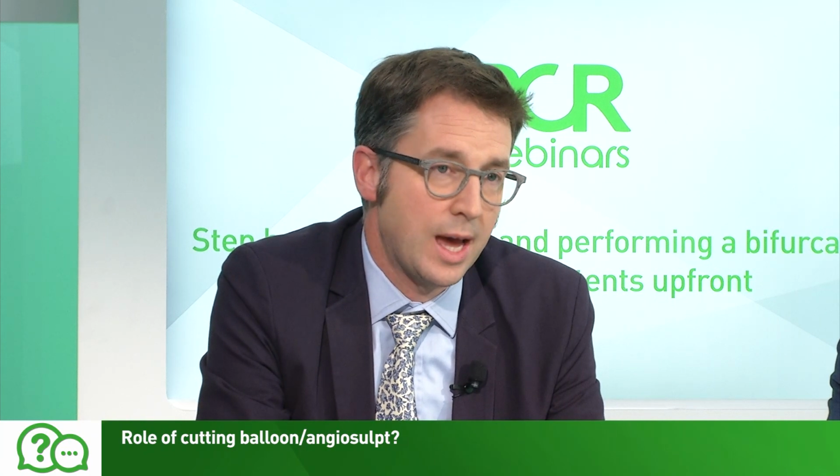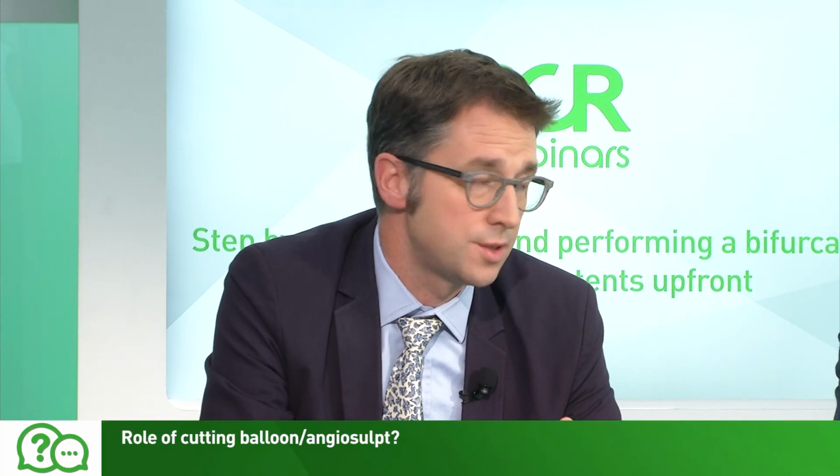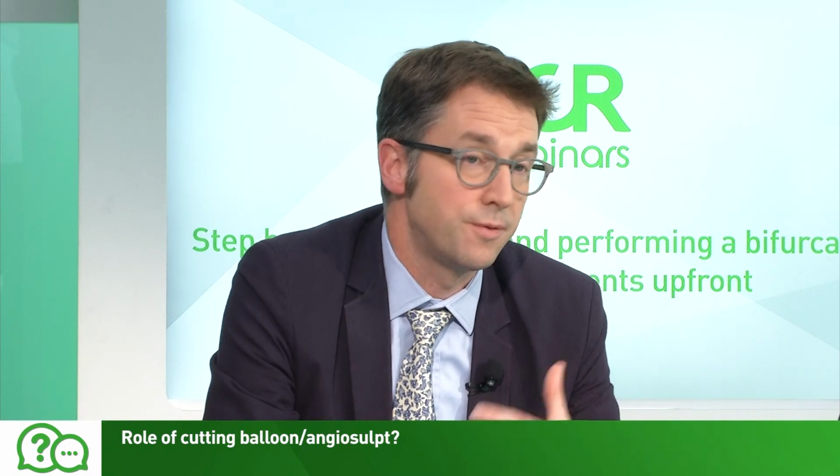Yeah. The role of cutting balloon and AngioSculpt probably after rota, so that may be considered overkill. It's just really to be absolutely sure that we have optimized as much as we can, that we see expansion. The last thing you want is to deploy your stent and then find that you've still got quite a significant residual stenosis. So the taking of a non-compliant balloon at that point was important. I just happened to use a scoring balloon in addition to further maximize the preparation.